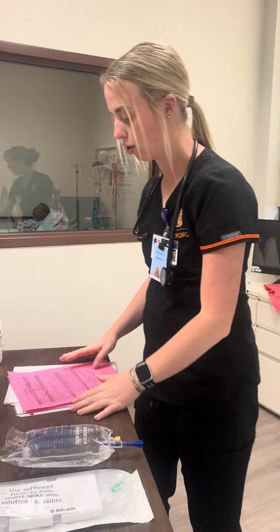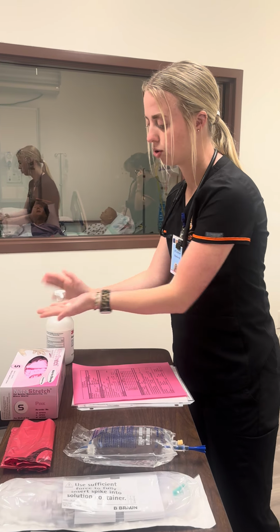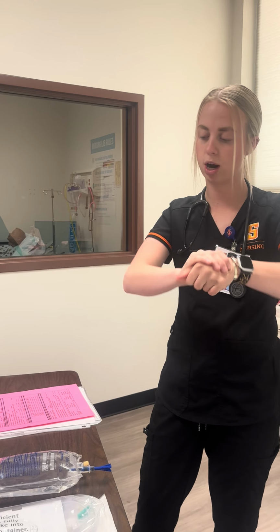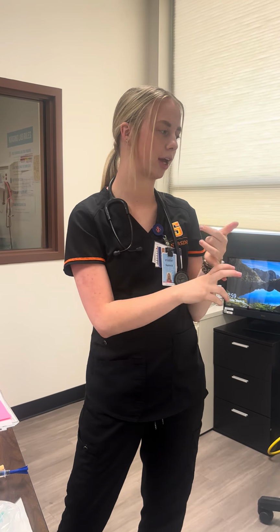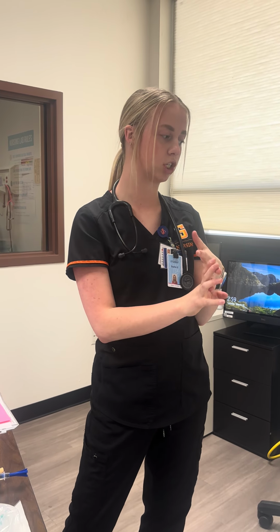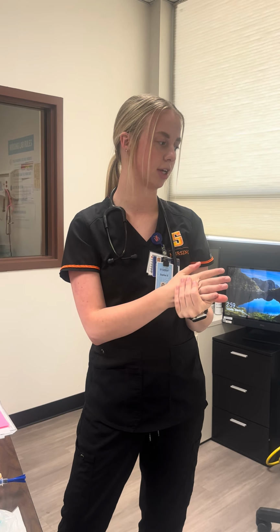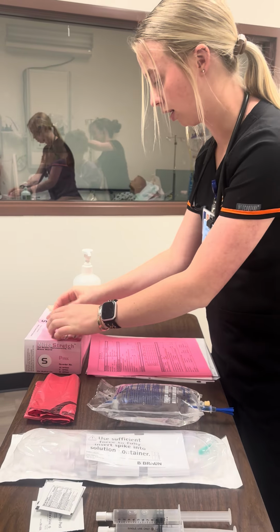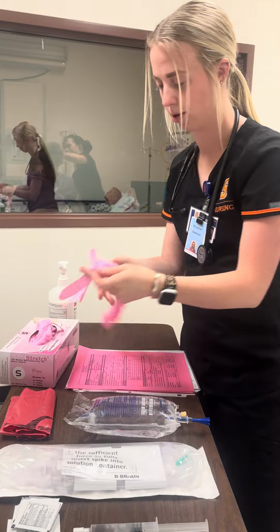So now that I'm in the room, I'm going to prepare the normal saline. So I'm going to do hand hygiene, make sure that we have that privacy still. I would also check for itching, hives, rash, and teach those to my patient to report immediately. These are all signs of an adverse reaction in our patient during this blood transfusion. So I'm going to put some gloves on. I'm really shaky, so please ignore that.